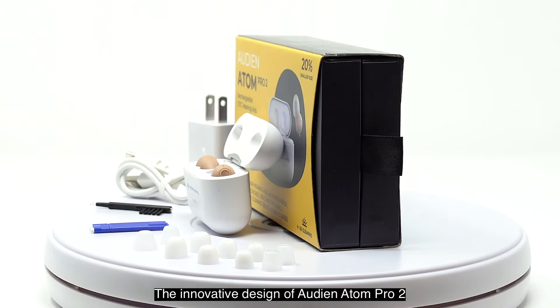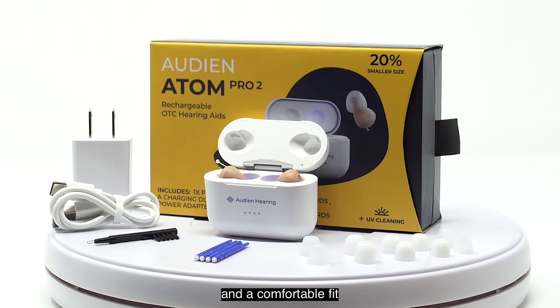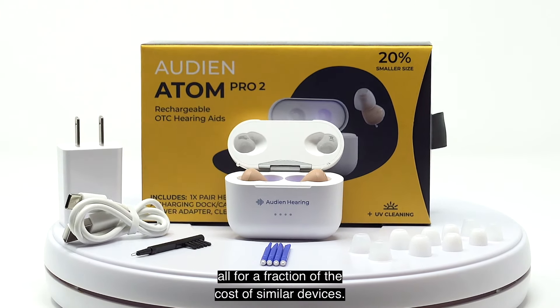When the charging case is plugged in, the lights on the front will flash green, indicating the case is receiving power. Once all four lights on the case are green, the case is fully charged.